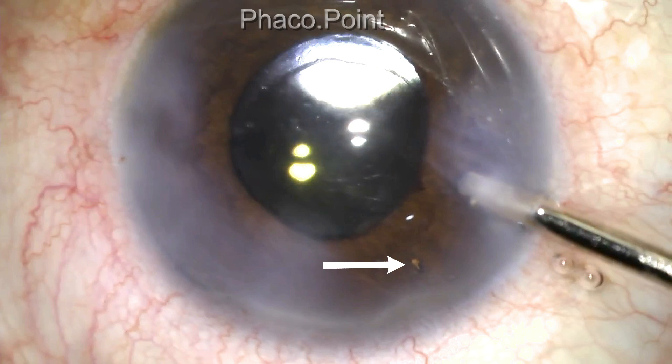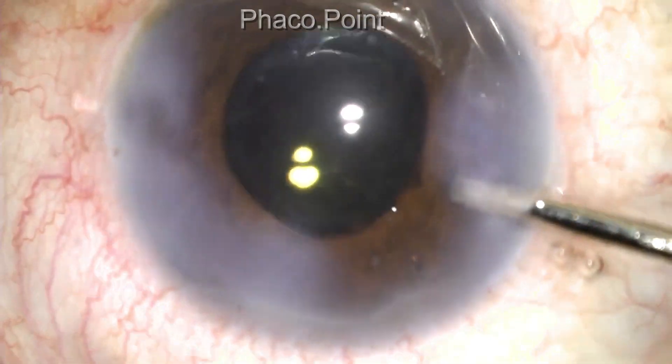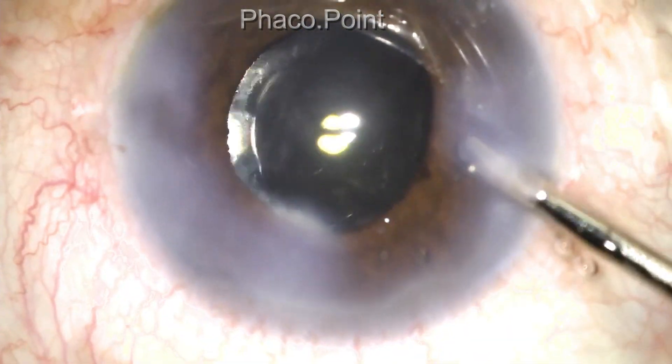I think the advantage of this technique is that it's simple, safe, easy to perform, and hardly requires any instrumentation. You do not need to use a retractor or any kind of scissors to create an opening in the peripheral iris.